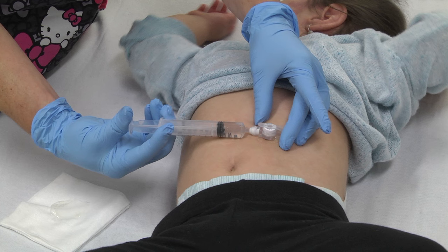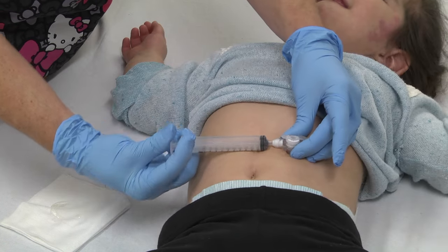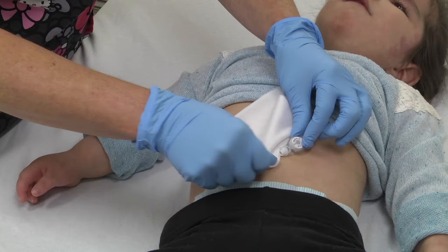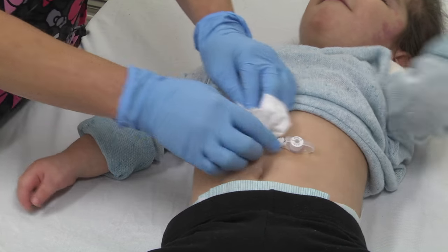Inflate the balloon with three to five mils of water depending on the size of the Mickey and desired fit. Your nurse will advise you how much water to inflate the balloon with. For 12 French G-tubes, three to five mils maximum; for larger sizes, maximum 10 mils.